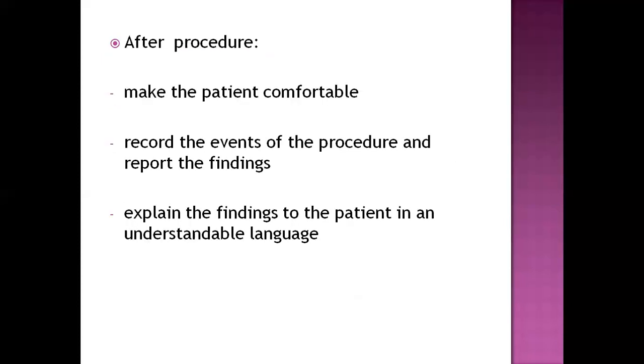After the procedure, what nurse should do is, first of all, make the patient comfortable again, record each and every event that happened during the procedure, and make a conclusion of the findings of that procedure. The nurse should explain the procedure to the patient in simple and understandable language. Nurse should try not to use too many medical terms that a layman cannot understand. She should use simple words and explain the findings of the procedure to the patient.